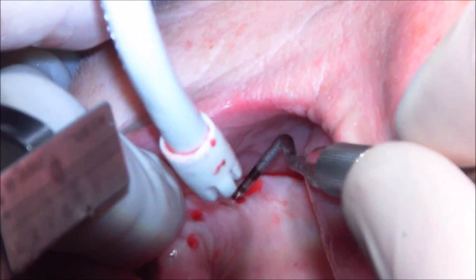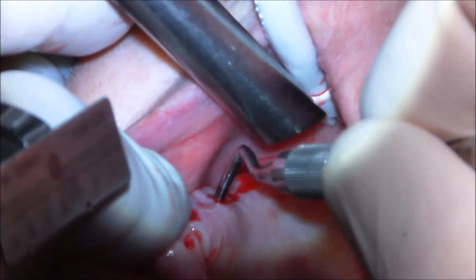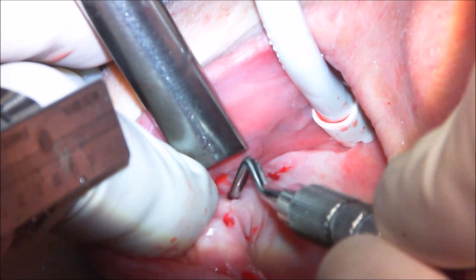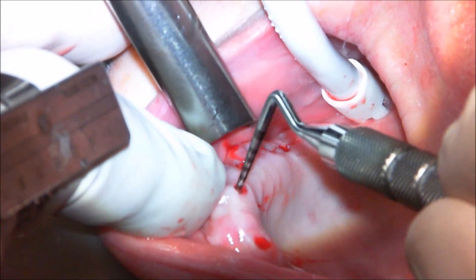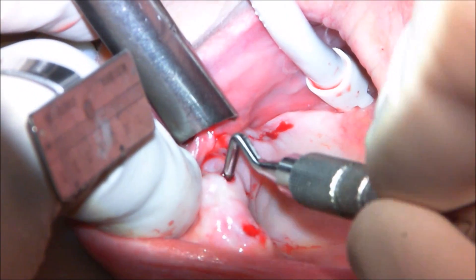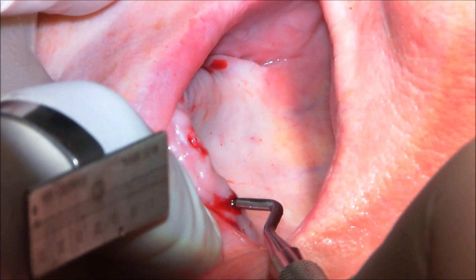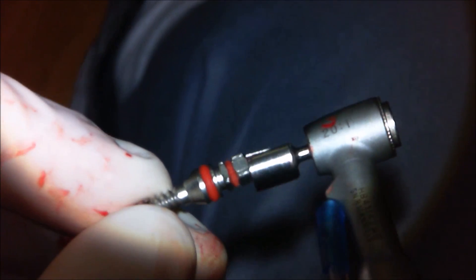Now I'm taking a blunt ended probe and first verifying that I don't have any perforations into the sinus — which I did not. I then go through all of the other sites, probing against all walls — buccal and palatal — making sure there are no perforations or fenestrations. If there were, it might be necessary to flap and potentially place a graft. But having planned this on CT and being confident in the guide fit, I didn't anticipate that being an issue, and it wasn't. I always verify that, though.